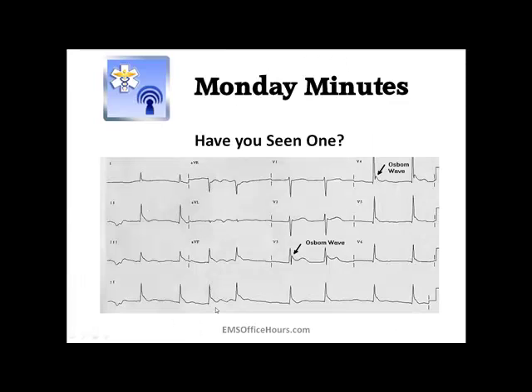Now this next one shows it in V3 and V4 — pretty easy to see it there, and probably if you look close enough in V5 and V6 you can almost make it out as well. If you look at leads 2, 3, and AVF you can probably make out the J wave — more prominent in lead 3 and AVF — but it's most prominent here in V3 and V4.